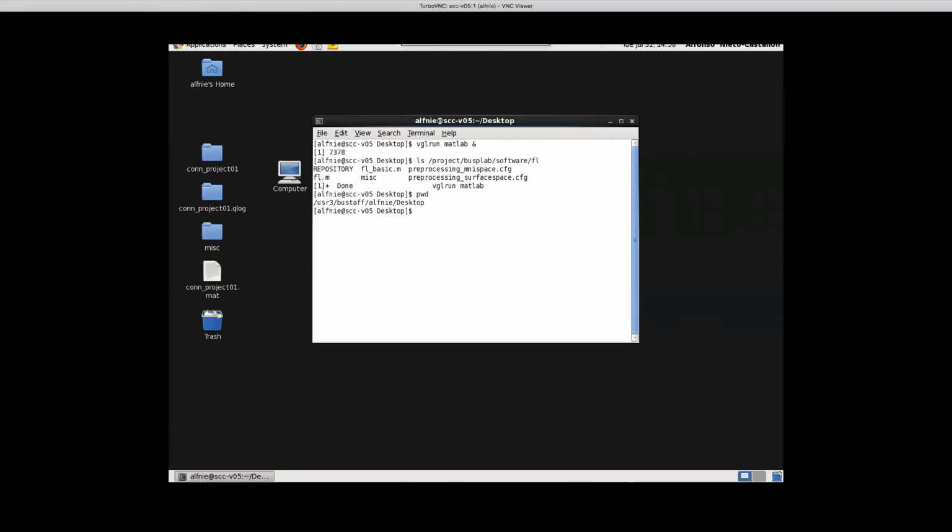And the second is having the sampling of those vertices, the triangles that represent the entire surface of the volume, be relatively equal in size. So you want the triangles to be the same size in one portion of the brain and another portion of the brain, and the way to do that is to resample them into this relatively similar triangular tessellation of the sphere that FS average actually is.